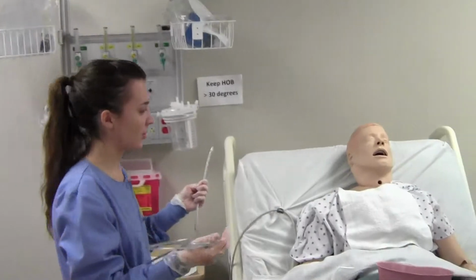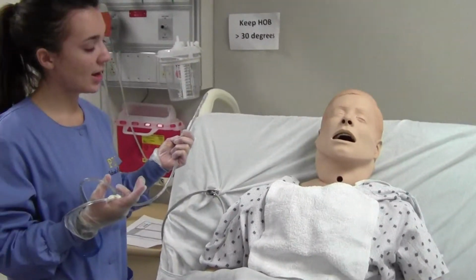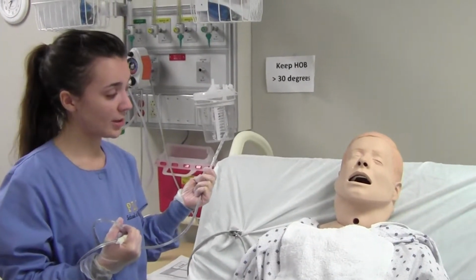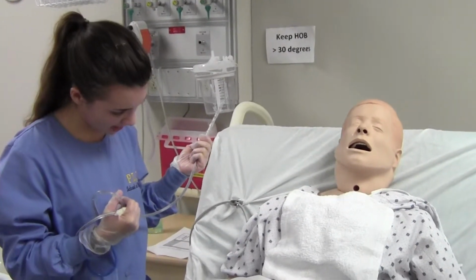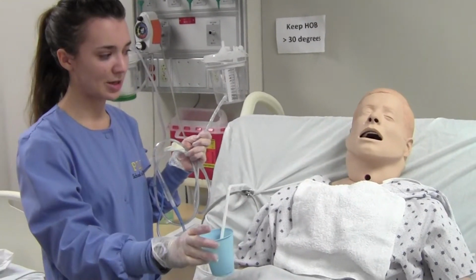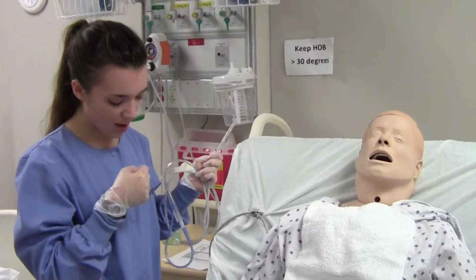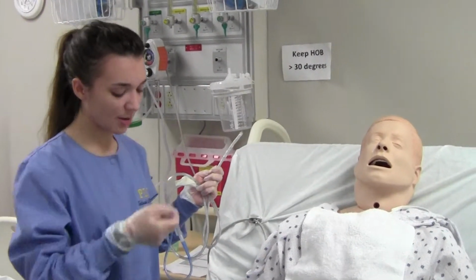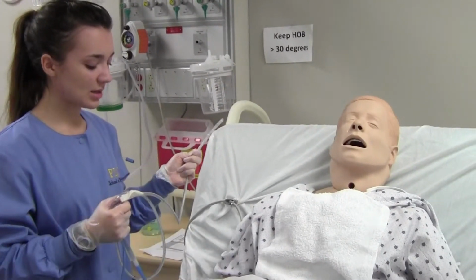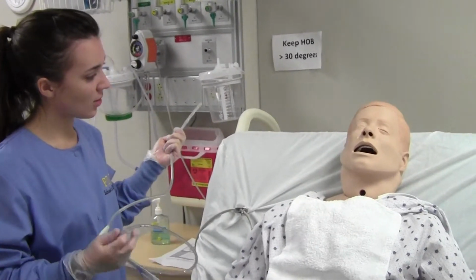Okay, now, before we begin, again, I'm going to have you start off with your head tilted back, which it is back. When you're inserted in 4 inches, you're going to gag, and I'm going to pull back a little bit, let you recover. You're going to help me out by tilting forward. You're going to take this water, I'm simulating putting this in the patient's hand, and you're going to grab your water up, you're going to take a sip, and then when you take a sip, I'm going to push it in. I'm going to ask you to take another sip, you're going to push it in, and so on until we have it in. This isn't a comfortable procedure, but it should be quick, okay? Alright, so are you ready?